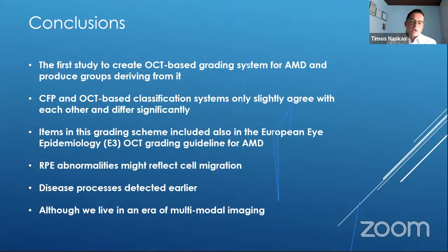Although we cannot now say that we can change one imaging modality for another. We cannot say that. One imaging modality cannot be exchanged for another because we live in an era of multimodal retinal imaging. Several devices offer different imaging capabilities, and each imaging modality can also convey different information in terms of pathological processes going on in the retina. So that would close the part of the research.